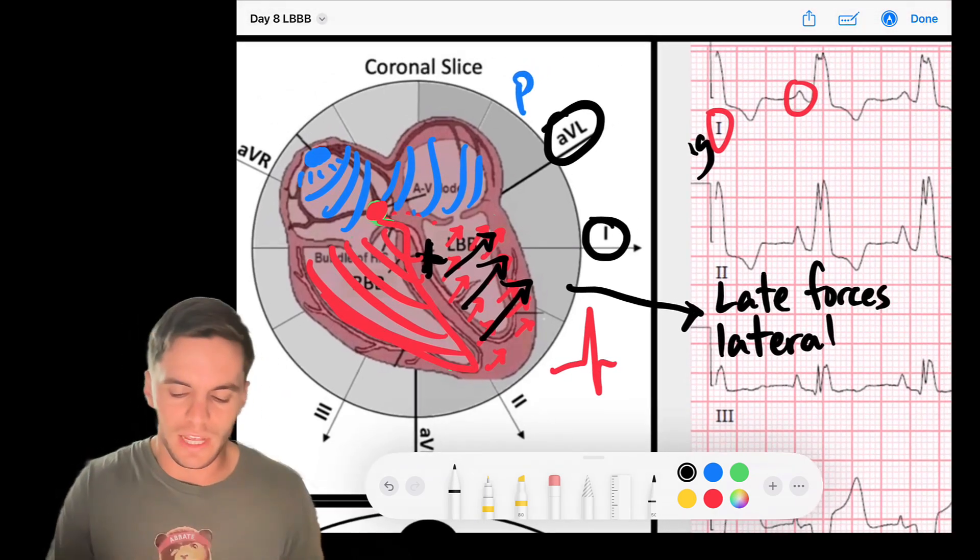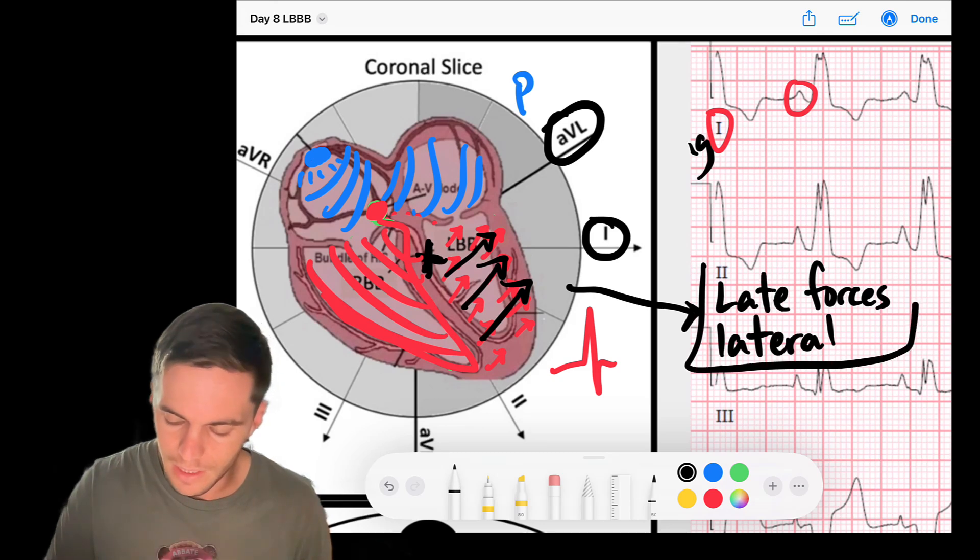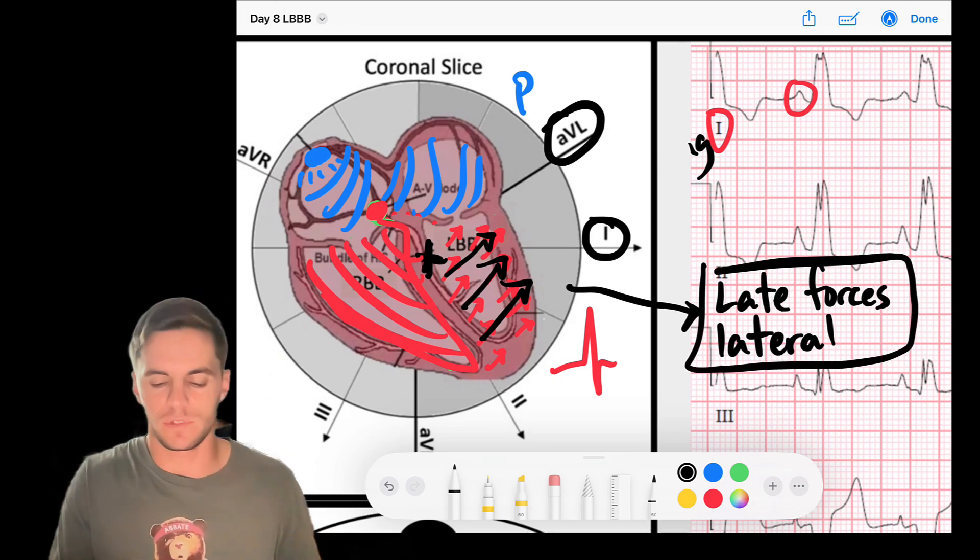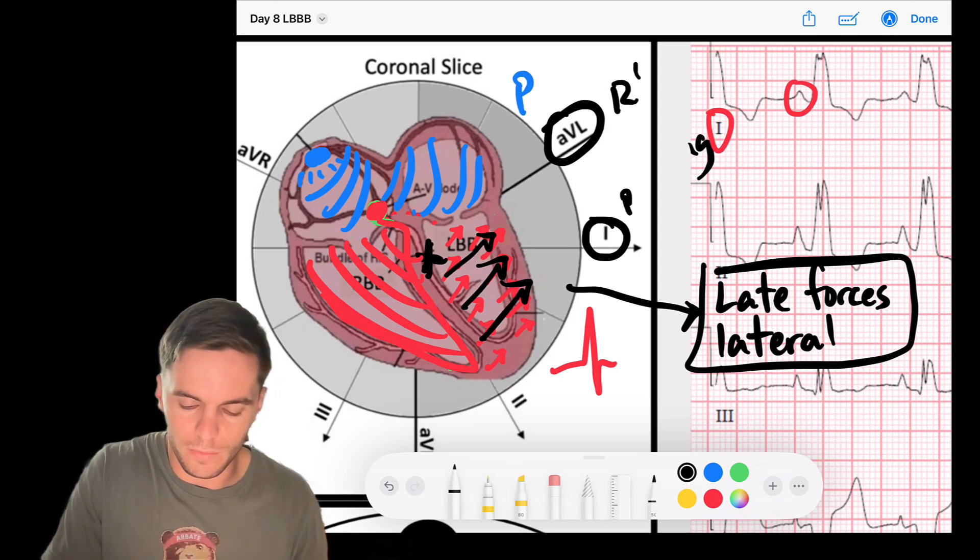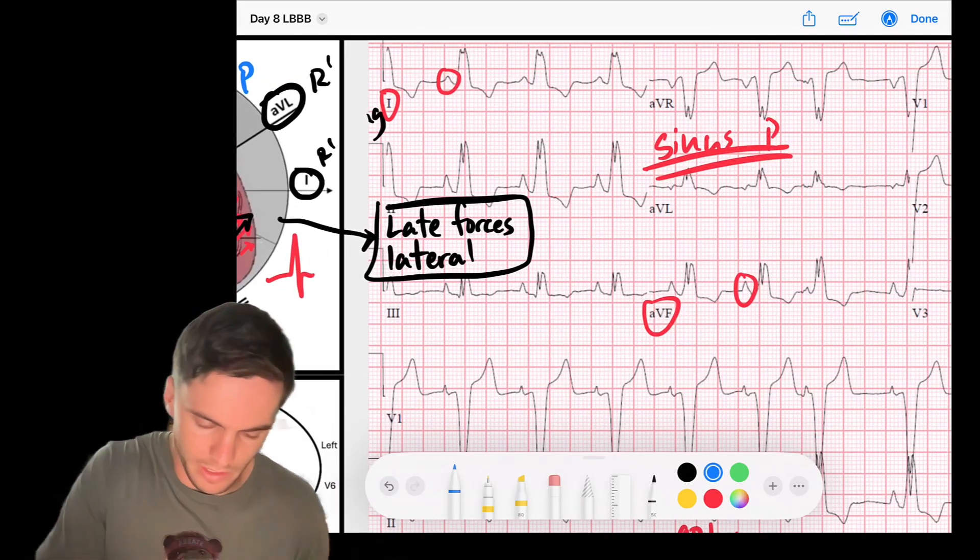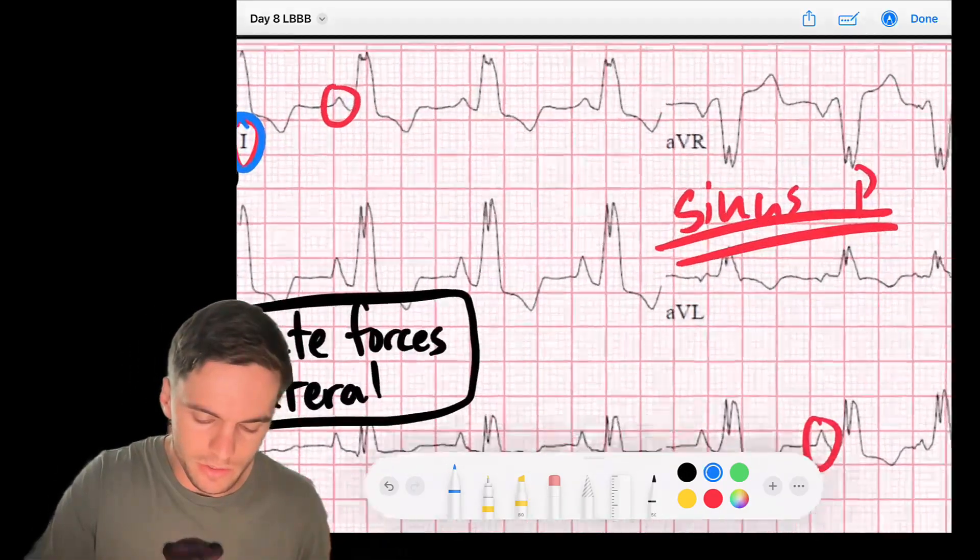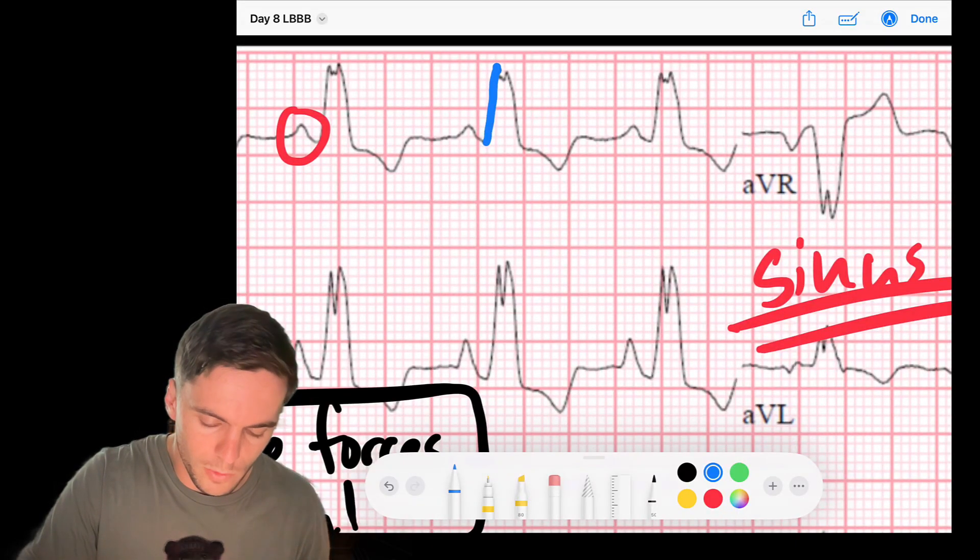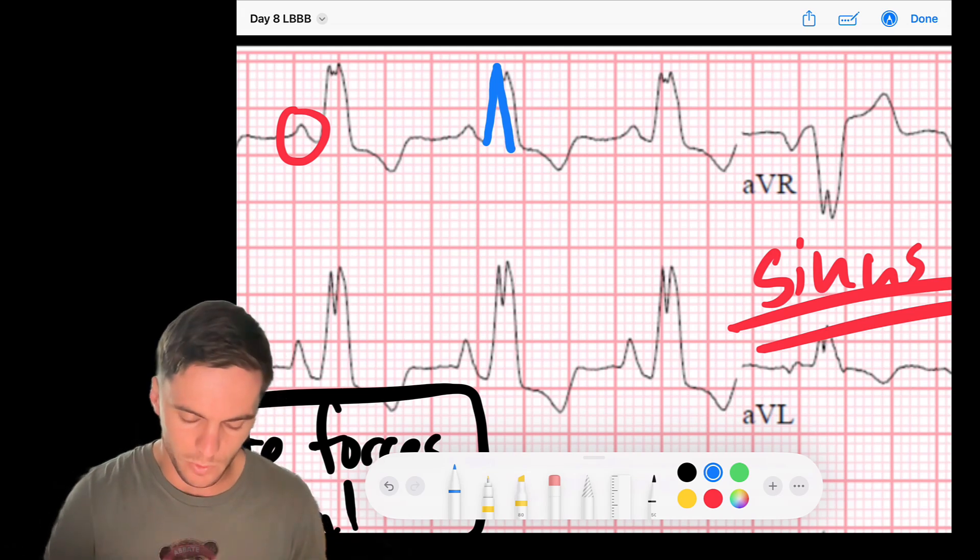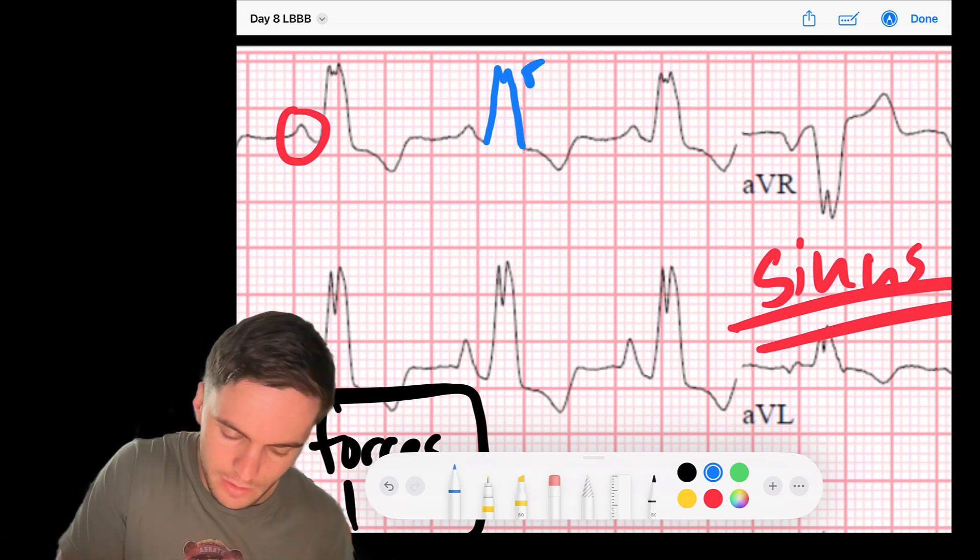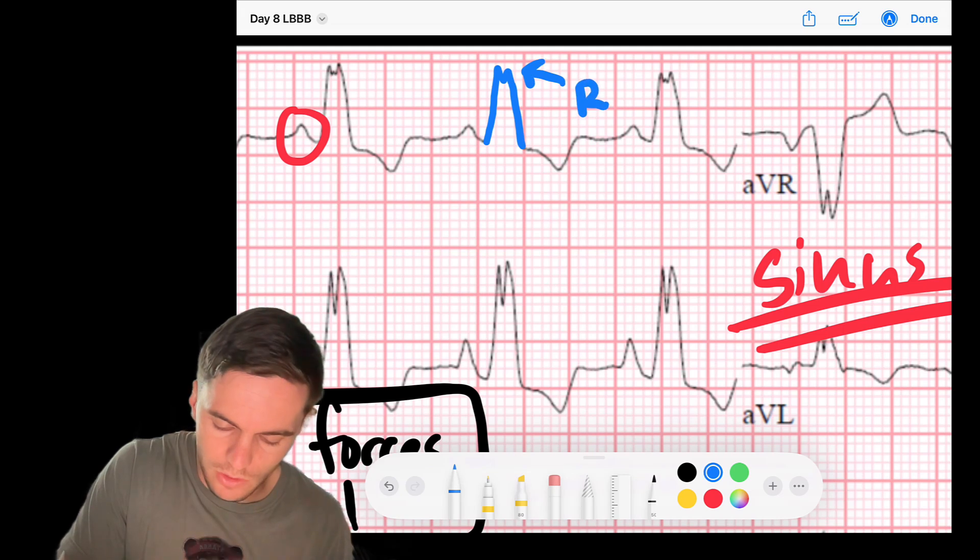What leads are going to capture those forces positively? Leads 1 and AVL. And so what we'll see in leads 1 and AVL are these late positive forces that will end up being what we call kind of an R prime. So we should see some type of R prime. And so if I take a look here at these leads, lead 1 right here in blue, if I look, notice that after the onset of my QRS, my QRS should normally return back to the baseline. But look what I have here. It actually goes up. And then as it tries to return back, it actually gets the second positive R wave. And that right there is an R prime.